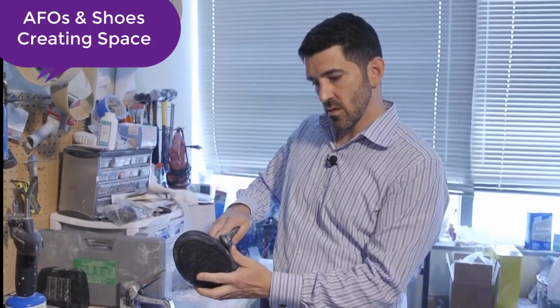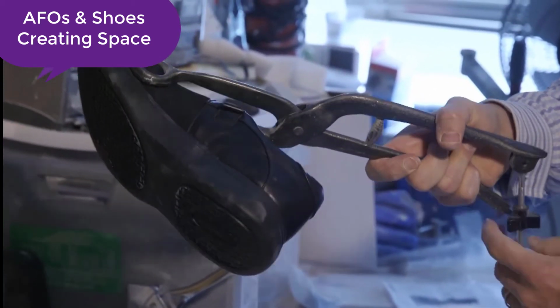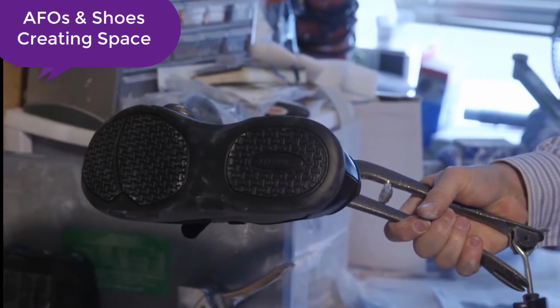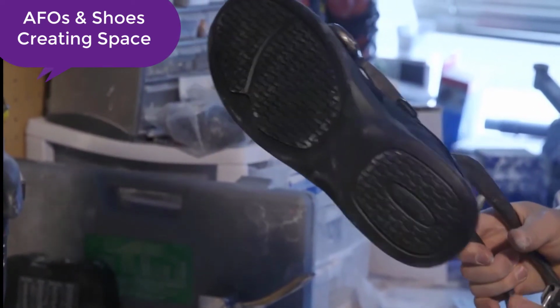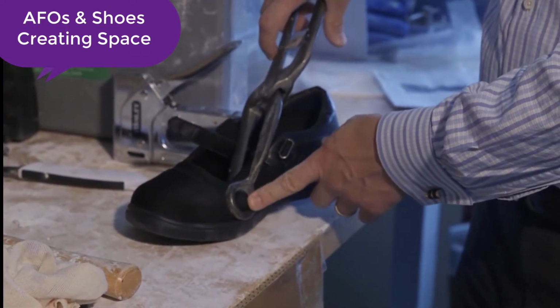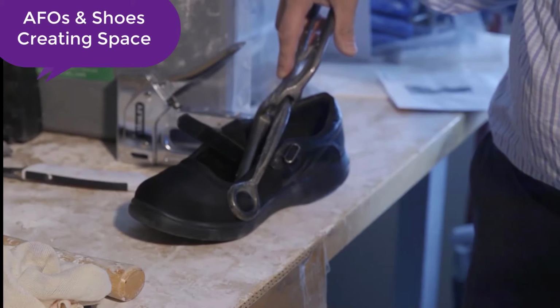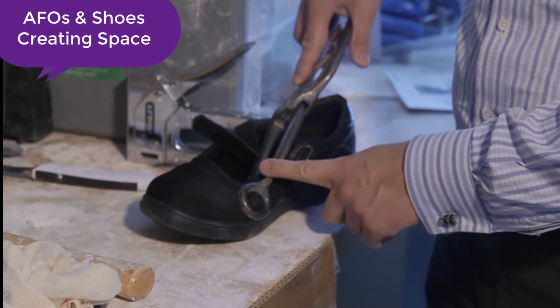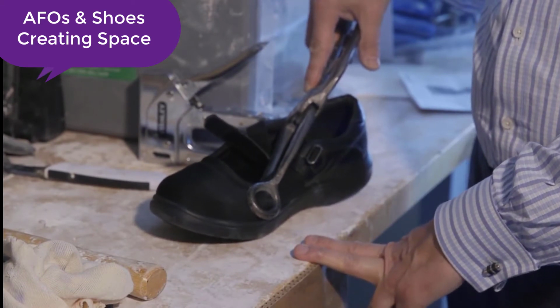So they would come in like this, and you can see it start to press out that material right there. And then the AFO, then the shoe, and we can lock this in right here, and begin to really crank down in a safe way on the material. So you can see that bone now, the first metatarsal, will be able to have more room inside that shoe. An orthotist would now leave this shoe. There is no exact time frame, but definitely you'll see results after 20-30 minutes for sure. So this is the shoe stretching tool, and it can be used to help a patient with their AFO compliance, activities of daily living, and help them ultimately walk better if they have comfortable shoes to wear.